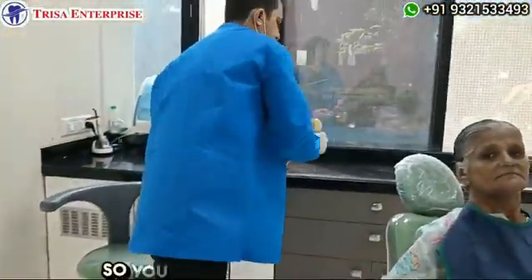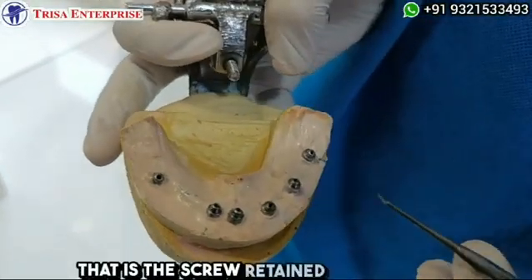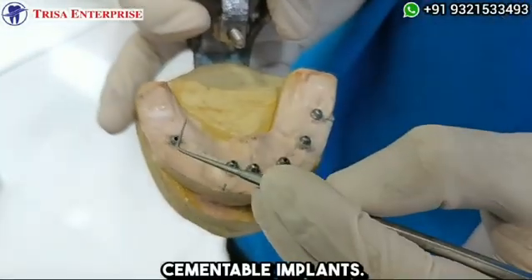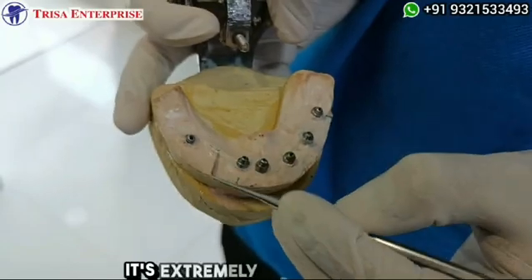In the lower jaw we have used the latest design — the screw-retained MU implants. The upper is the traditional cementable implants. You can see here how the prosthesis is going to come together for these extremely resorbed ridges.